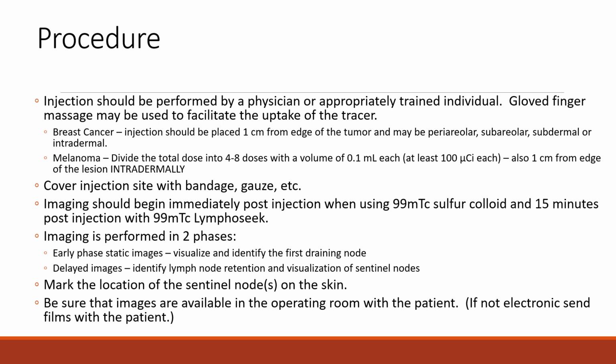If you don't do imaging, most people would just look in the axilla for those sentinel nodes, and he would have found some, would have completely missed the lymph nodes in the neck and in the groin. And I have seen melanomas in the back where it went both ways. And so your lymphatic system can be kind of complex.